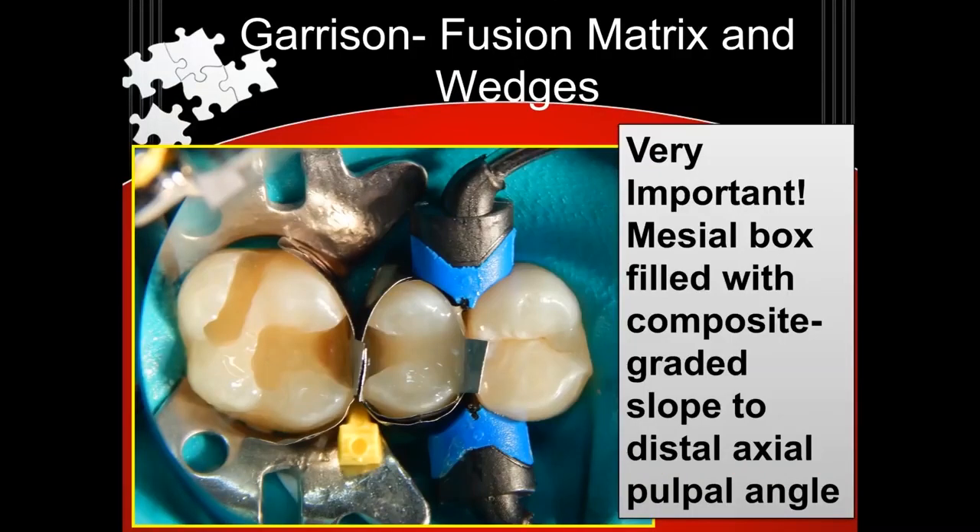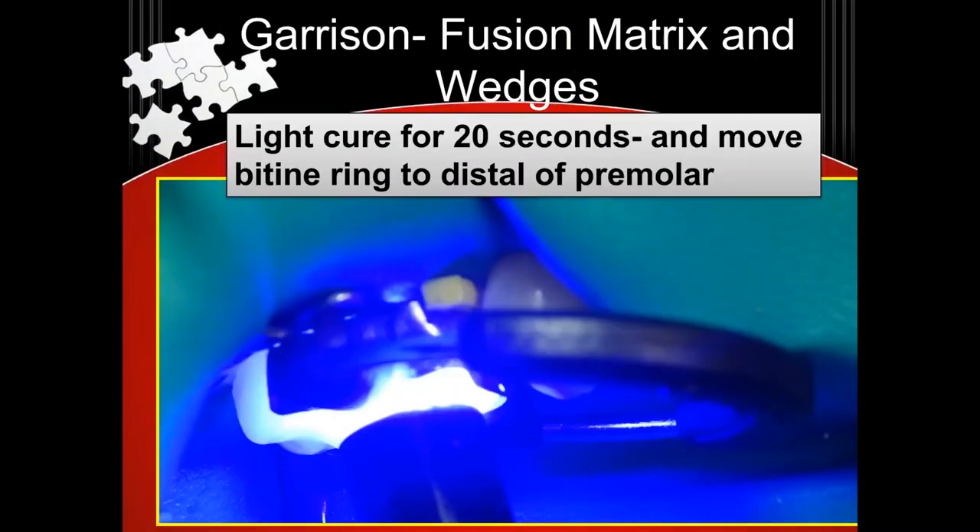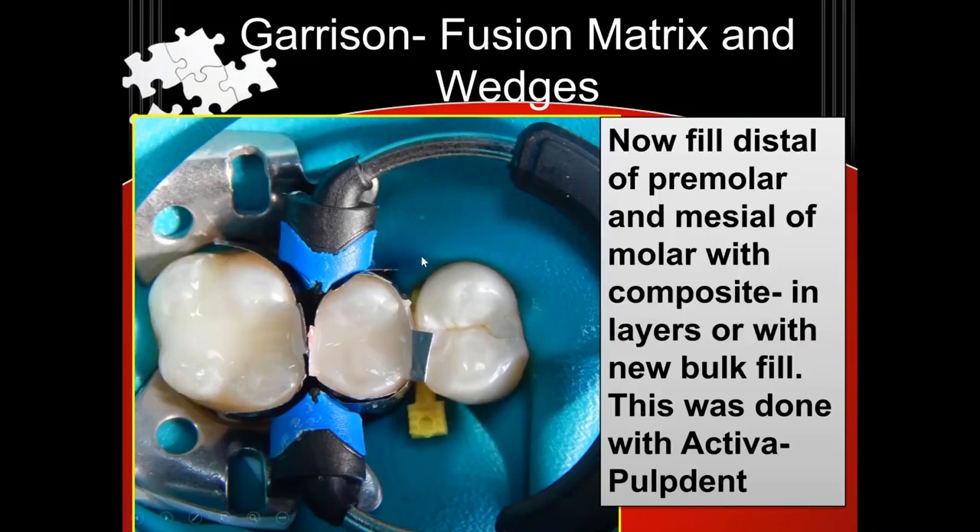After I have the adhesive all cured, I'll inject my composite — or you can pack your composite, whatever — just in the mesial component and make it a little slope. You see, just the mesial component is filled on that premolar. I'll light cure that. And then I'll move my bi-tine ring. The reason I do that is when I have my bi-tine ring here, it's separating that way and that way. If I double bi-tine, that force will be negated by that force. So to get a tighter contact, I'll get this done.